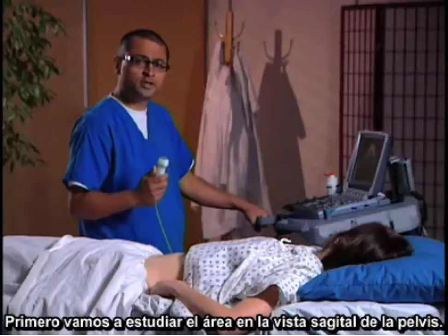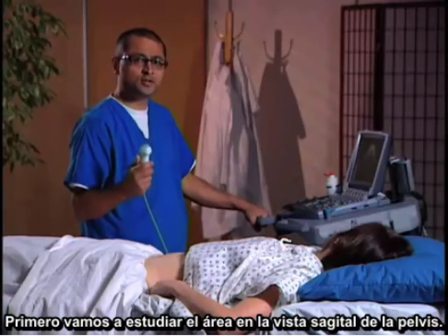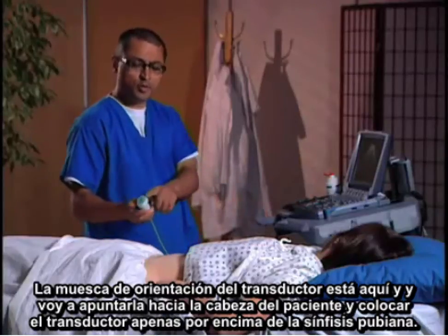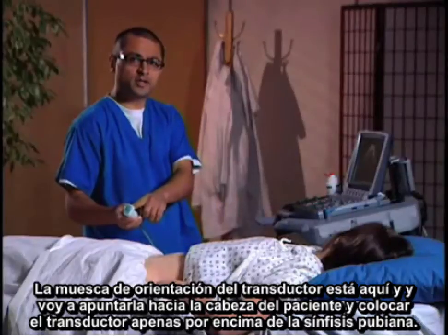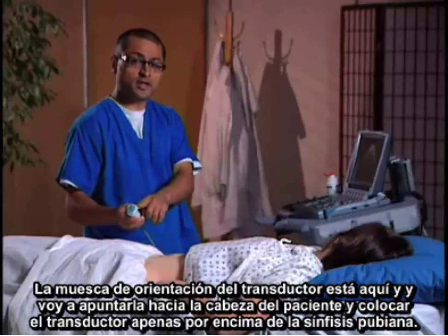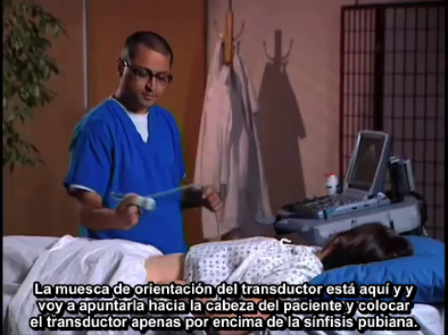The first area that I'm going to scan will be a sagittal view of the pelvis. The probe marker is right here and I'm going to aim that toward the patient's head and place it just above the symphysis pubis.